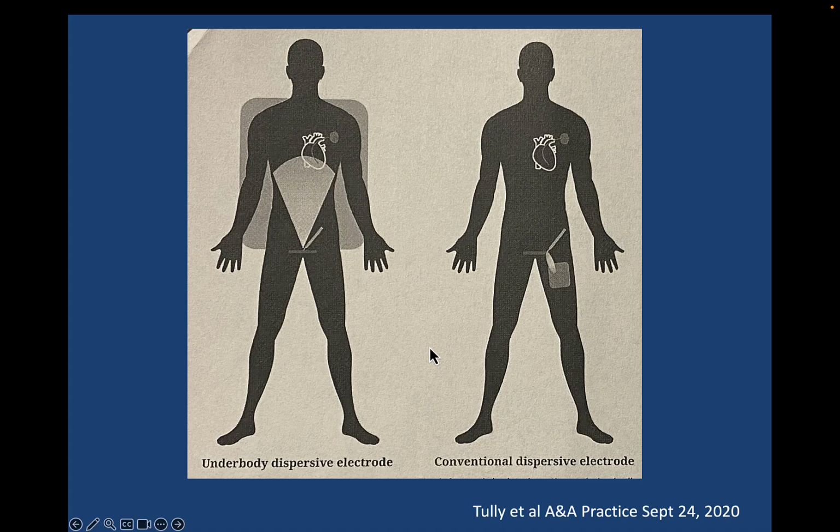And so in a typical patient, the cautery stream can be minimized depending on where you put the Bovie return pad. But with the Megadyne system, if the cautery is applied here, it's dispersed throughout this large electrode that the patient is lying on, and it's much easier for the ICD to sense that cautery.